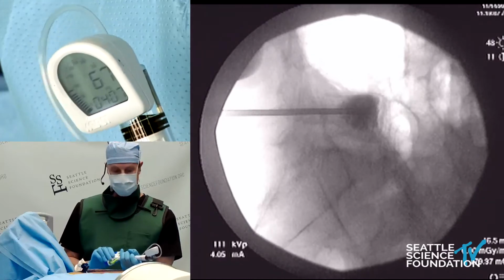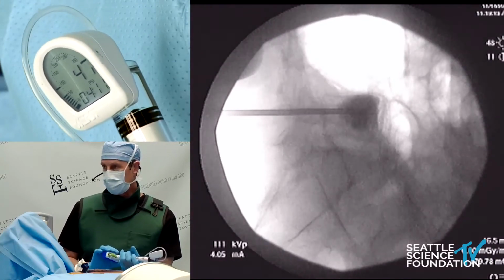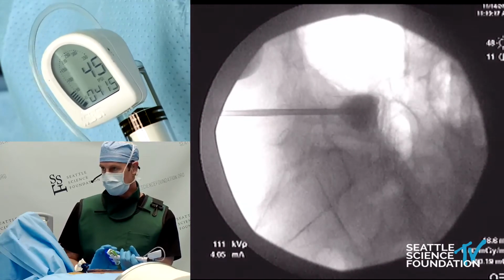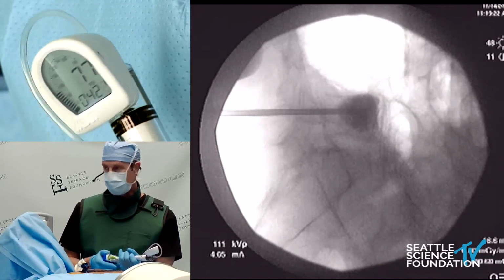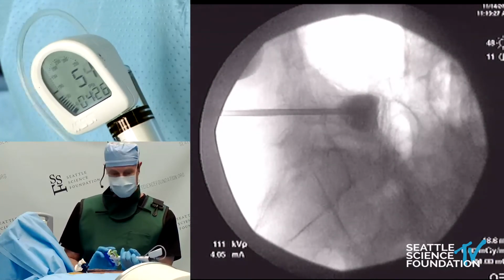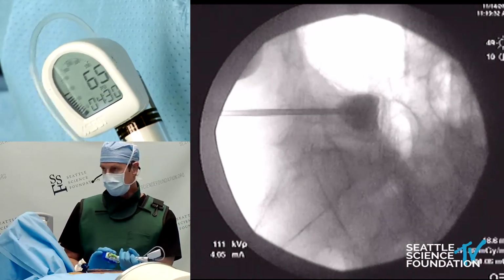High compliance is like a balloon that tends to blow up and form balloon animals. It will herniate out through the disc, will go through the end plates, go out the side. These low compliance balloons tend to stay where they're placed, high pressure, and tend to be a really excellent way to reduce the vertebral body in a very predictable manner.